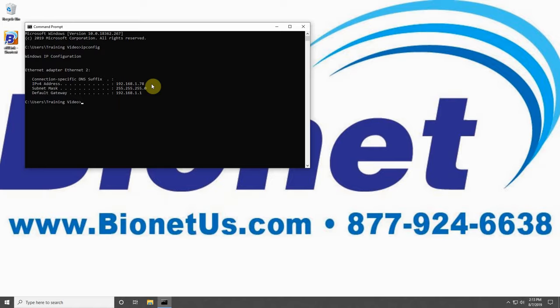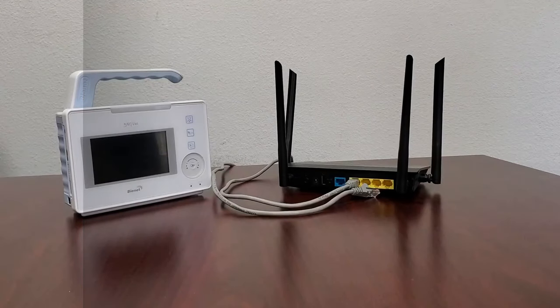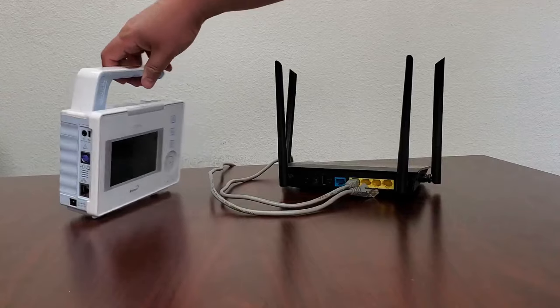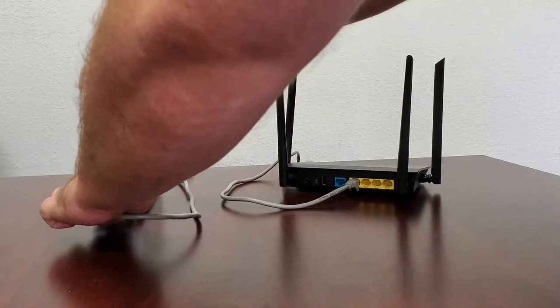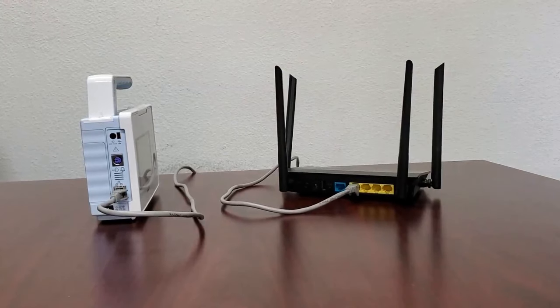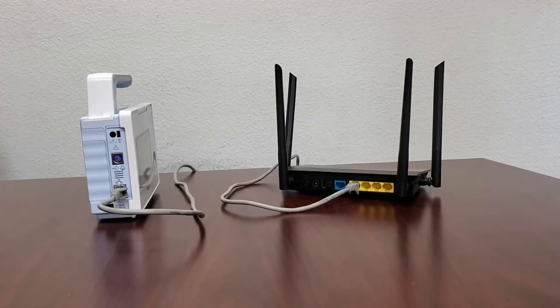Let's begin by going over the steps to connect the BM1 VET to B-Link. Begin by ensuring that your BM1 VET is connected to an internet router using an Ethernet cable. Ensure that the router you use is the same one providing a network connection to your computer with B-Link, as they will both need to be on the same network to communicate.